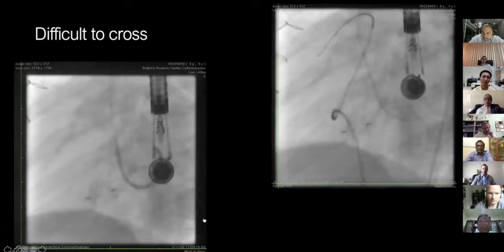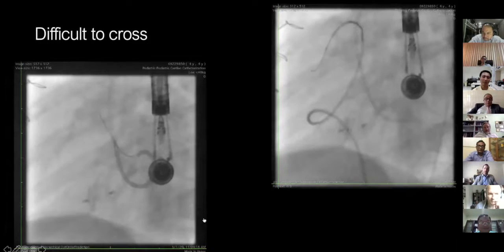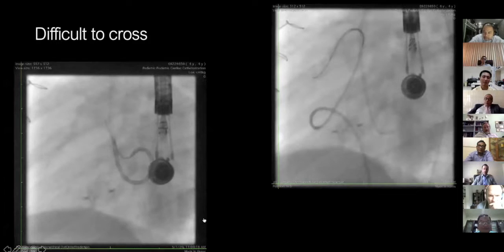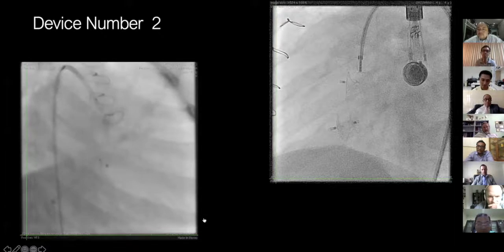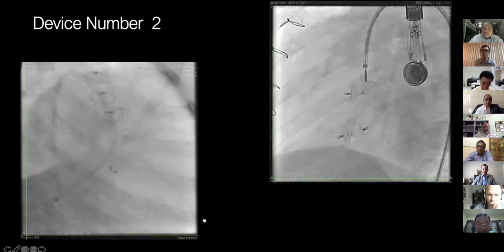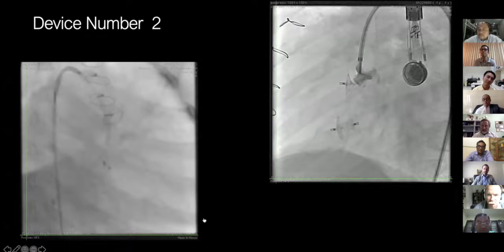But again, because of what I had heard from people's experience with tricuspid regurgitation, or in this case right AV valve regurgitation, we still decided to go from the aortic approach and deploy that right disc first, and then pull it across into the defect. And so you can see on the right screen there, we've got our right disc out, nicely through the defect, and that left disc out.